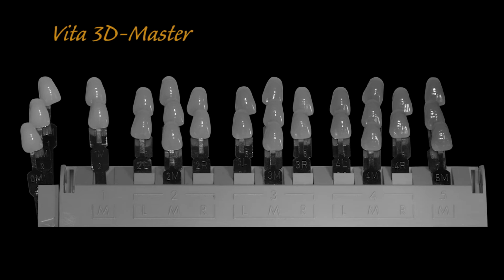If we pick the value and the value is correct and it comes back from the laboratory with the value correct, the hue and the chroma can be slightly off and it's still going to be accepted by the doctor and the patient. If the value is off, that is generally where most of your remakes come from. So the reason I like using the 3D Master Shade Guide is because it's a value-based shade guide.